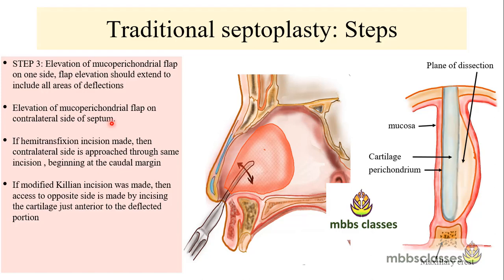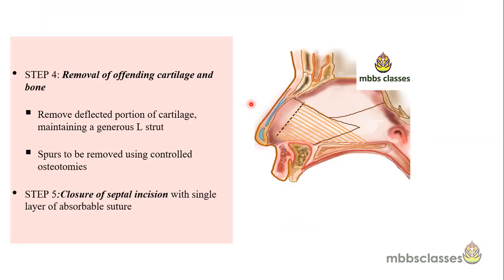Next, the mucoperichondrial flap is raised on the contralateral side. After one side flap elevation is done, an incision is made on the cartilage and the flap is elevated on the opposite side. If using a hemitransfixion incision, the contralateral side can be approached through the same incision; if using modified Killian's incision, access to the opposite side is made by incising the cartilage just anterior to the deflected portion.